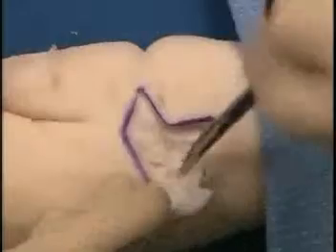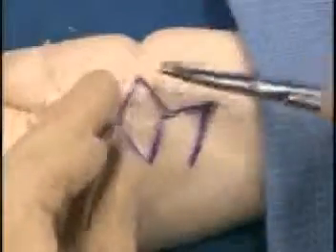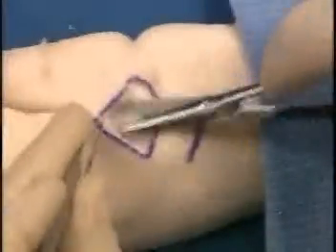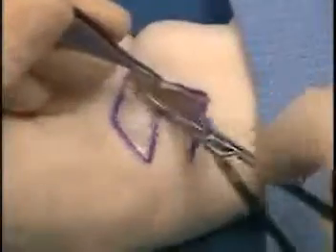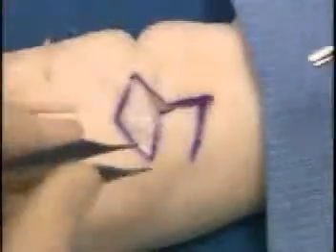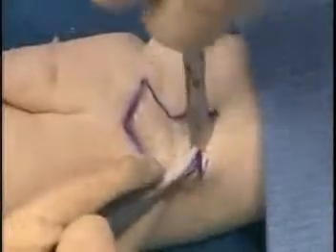Be sure to widely undermine this tissue, and again the tissue may be undermined using scissors or a 15 blade. You want it widely undermined so that the flap will be rotated into position so that it is not under any extreme tension. Notice the wide undermining in this particular case.